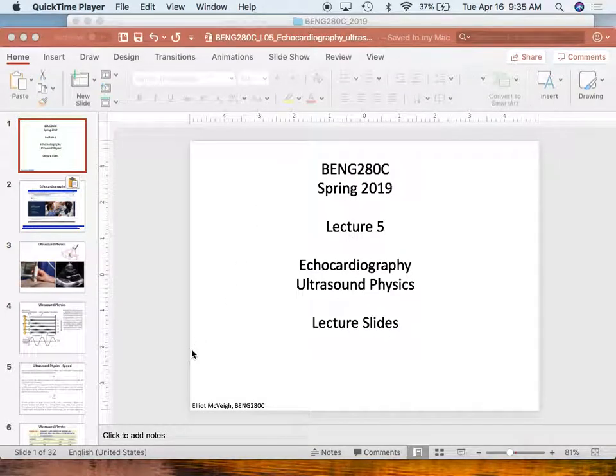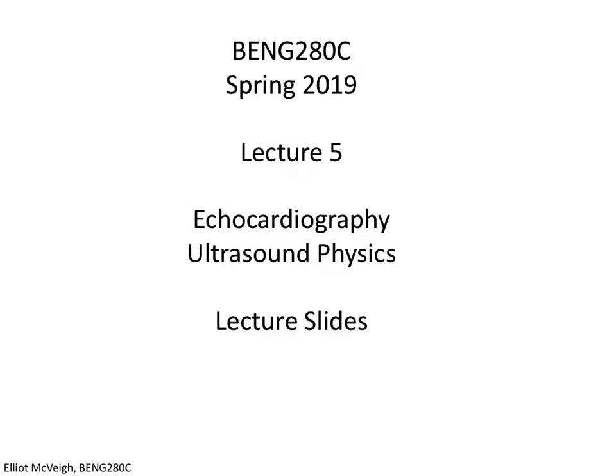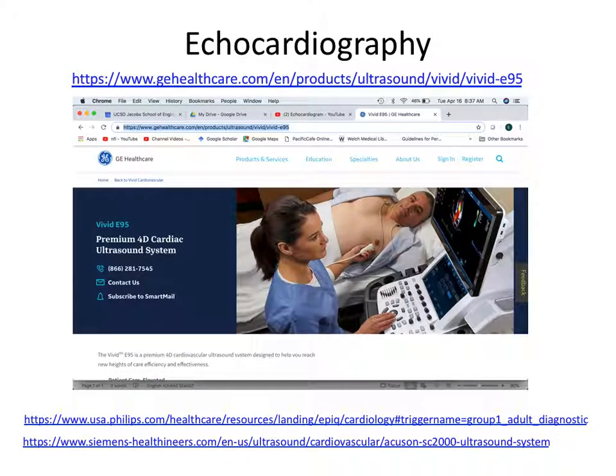Right, so today we're actually going to start looking at imaging physics. We're going to start out with echocardiography. And recall, echocardiography was this imaging technique where you have a transducer in your hand. The echo tech has the transducer in their hand, and they shoot a beam of sound into the patient, and they look at reflections of sound, and that creates images of the heart.